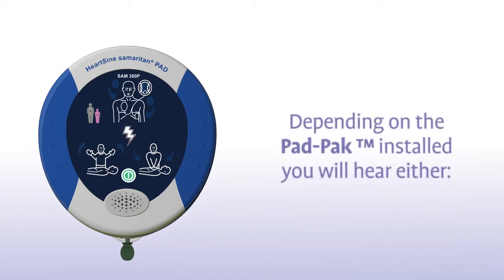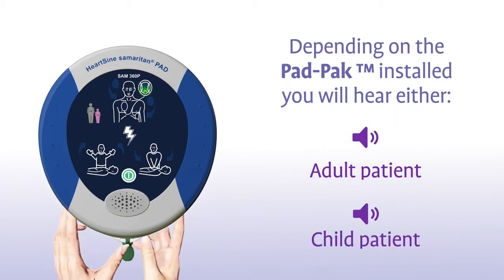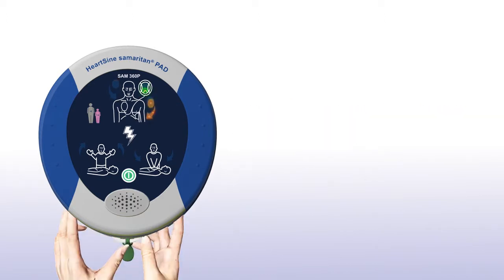Depending on the PAD pack currently installed, you will hear either an adult patient or a child patient prompt. If the patient is a child between 1 and 8 years of age, you should ensure a pink pediatric pack is installed. If a pink pediatric pack is not available, you may use the grey adult PAD pack instead.